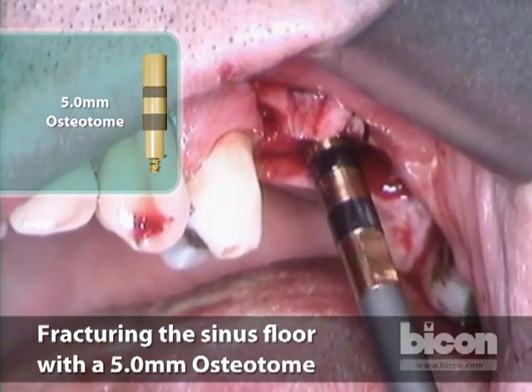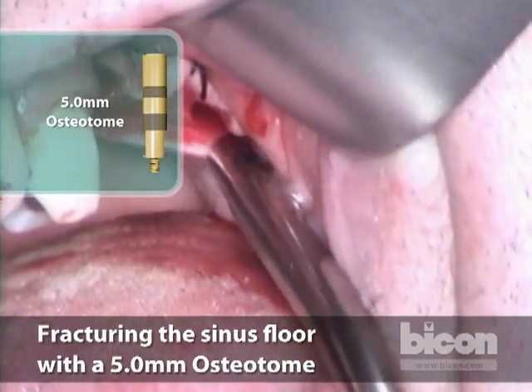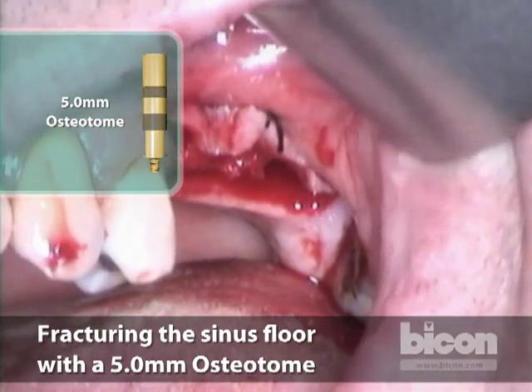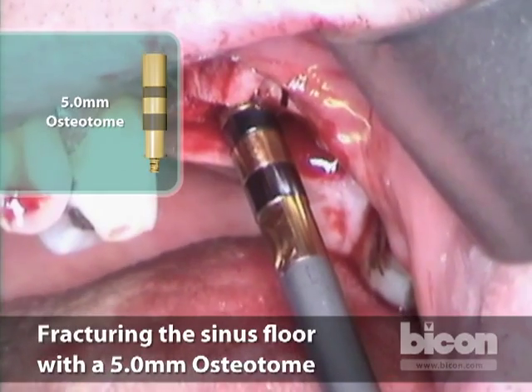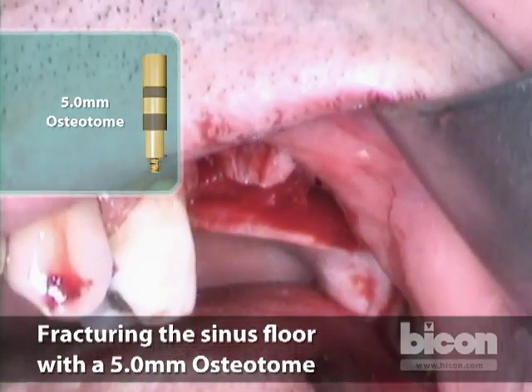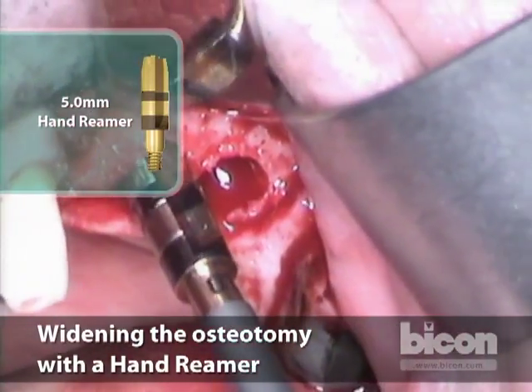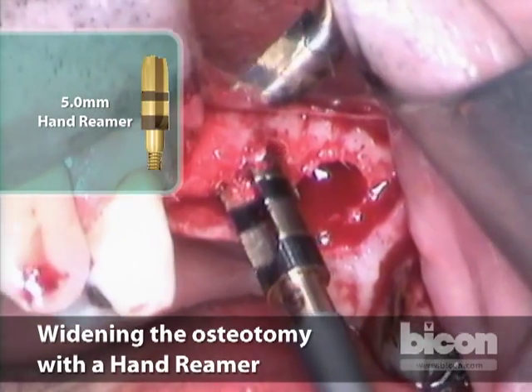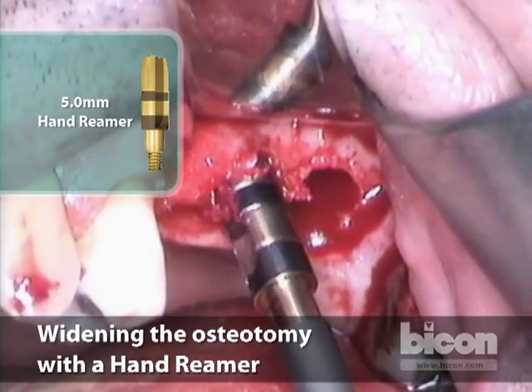What also happens is the buccal and palatal slopes can get involved because the ridge is not so wide. So you're not just fracturing a piece of floor — you may be compressing the bone first, so you give it a moment to rest. What we have now is a tighter, compressed floor. What we can do is shave it down a little bit and come back. Because of the offset at the very top of the reamers, it will take some of that compacted bone in the floor and shave it up.